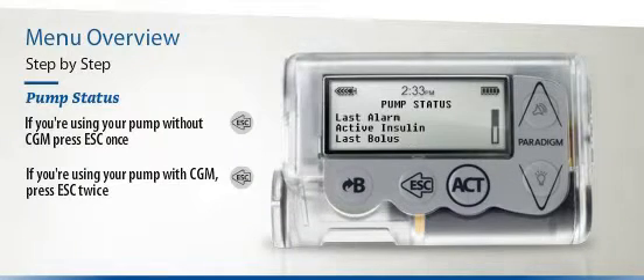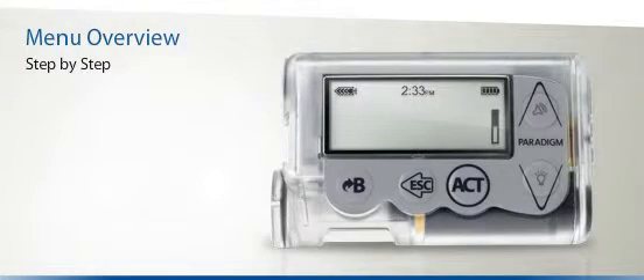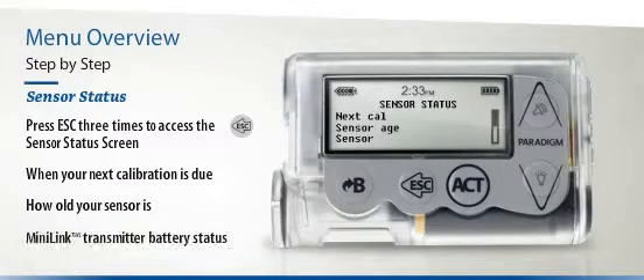The Pump Status screen includes Last Alarm, Active Insulin, Last Bolus, Basal, and many more, including the status of your battery, the current date, and your pump's serial number. If you're using the Paradigm Veo's Continuous Glucose Monitoring functionality, the Sensor Status screen is where you can find all the latest information about your sensor. It will show you the time when your next calibration is due, how old your sensor is, and the status of the Mini Link Transmitter battery.